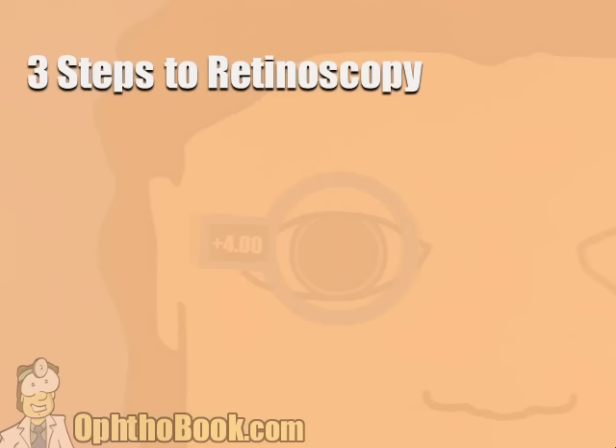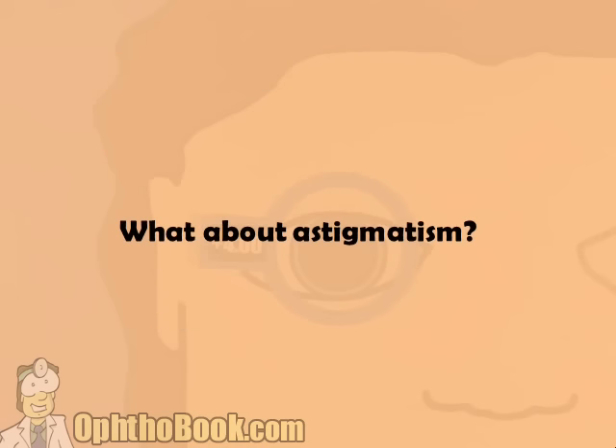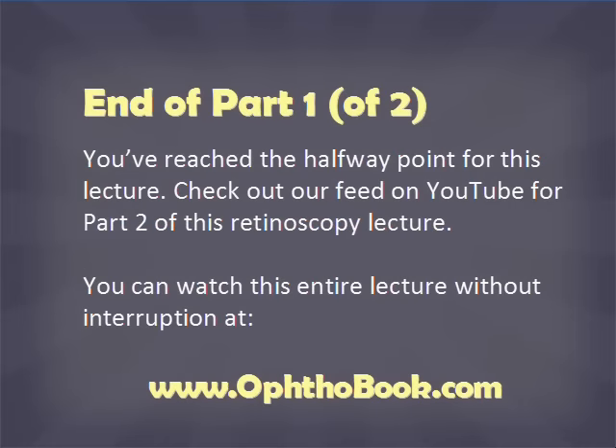So that's how you do basic retinoscopy. The three steps: you have to start with with motion, then add power to neutralize the reflex, and at the very end subtract a working distance to come up with your final prescription. What about astigmatism? This has been pretty easy so far — let's look at another eye. Step one: start with with motion.